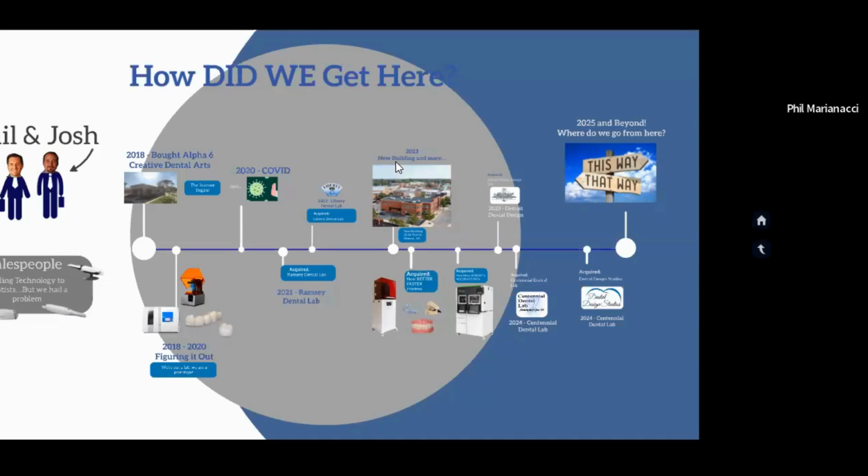We don't have salespeople or anything like that on board, but what we do is we utilize things that attract our clients, which is our dentists, that we're trying to bring value. And so this is one of the pieces, communication is what I value, and it seemed like the doctors valued it, and it worked. So this is one thing that you can do that will allow you to potentially work with more, reach out to more doctors and provide value. And along the way, we bought better, robust equipment so that we can work efficiently and have things mill overnight, and sometimes print overnight. Along the way, we just kind of adapted that type of technology and robust machines that we could afford.